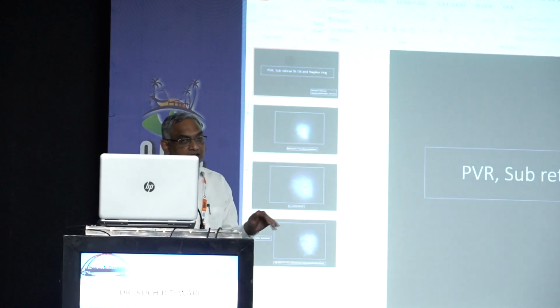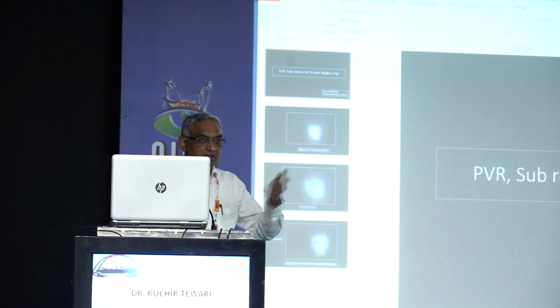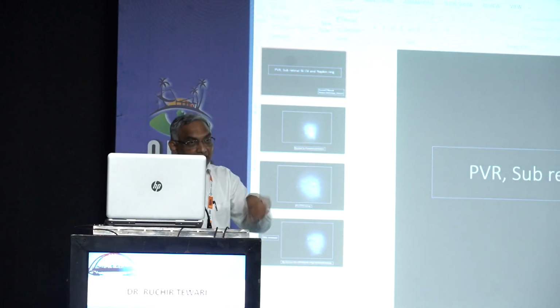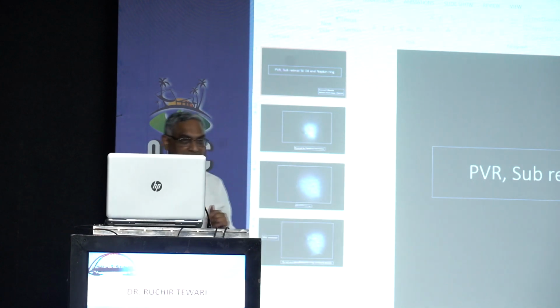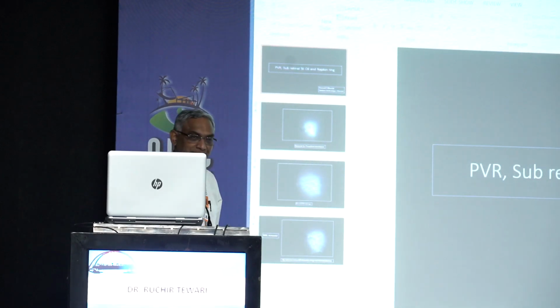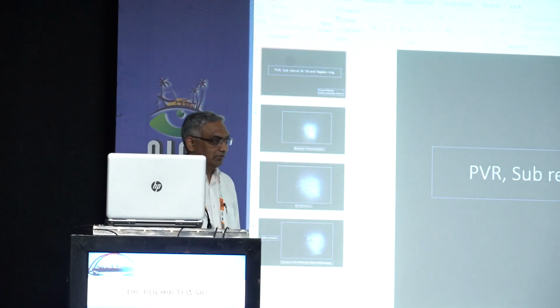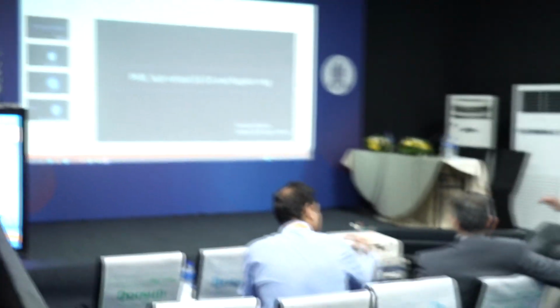So, of course, the lens will not be in the bag, but the second time when I plan SOR or something, after 3 months, 6 months, we'll have a proper calculation, have a lens in the sulcus, and again enter the capsule, you cut the central opening, a large opening, just short of the optic. In this case also, you can see the capsule has already started shrinking. Yes, it was shrinking. The capsule is getting phimosis. So over a period of time, it is going to shrink further.